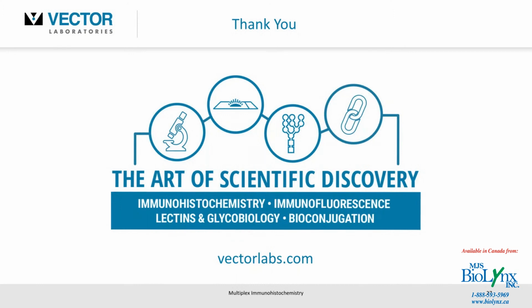So, yes, certainly you would run these sequentially. You would detect the first primary antibody, the first rabbit, with a given detection system. It could be peroxidase, and you develop with DAB. Then you'd apply the second primary antibody and run that through either with the same enzyme-based detection system and use a different colored substrate, or you would use a different enzyme-based system and develop with a different alkaline phosphatase-based substrate. So that would have to be run sequentially to avoid potential cross-reactivity.